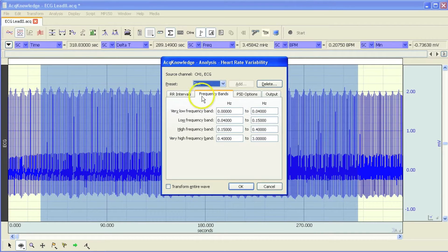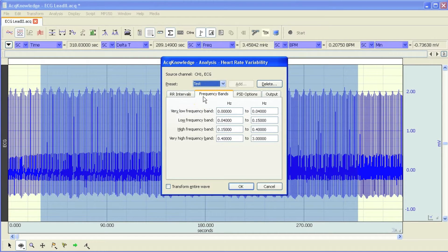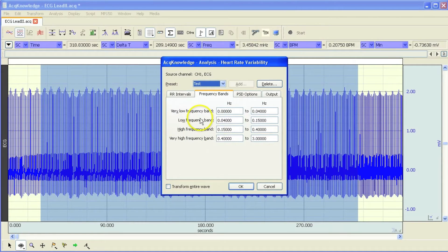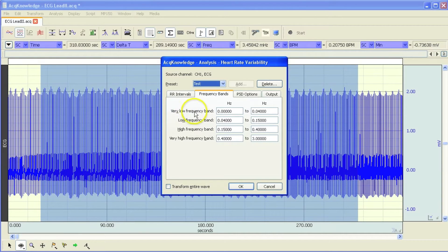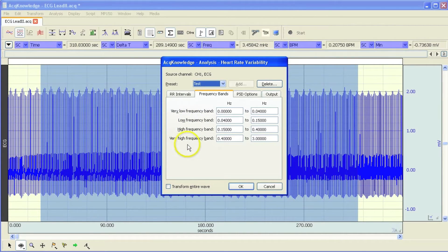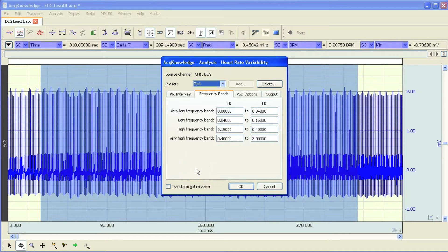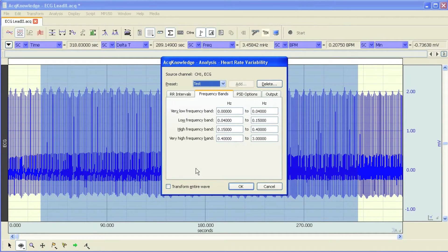As we work along the line of tabs, the next option you have is to adjust the frequency bands. The default settings are based on typical bands for this type of analysis. We've got the very low frequency, the low frequency, high frequency, and very high frequency, and these are based on the typical settings.